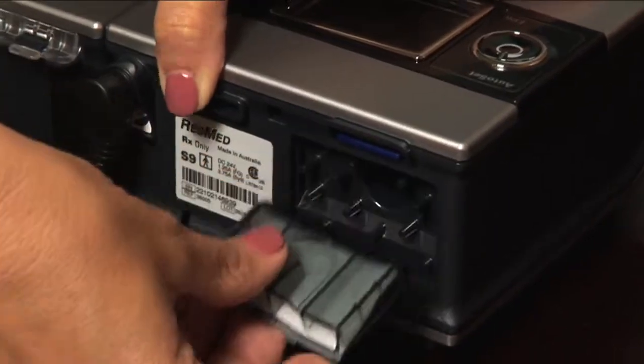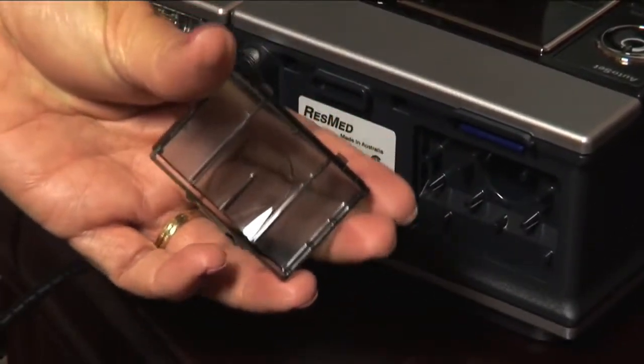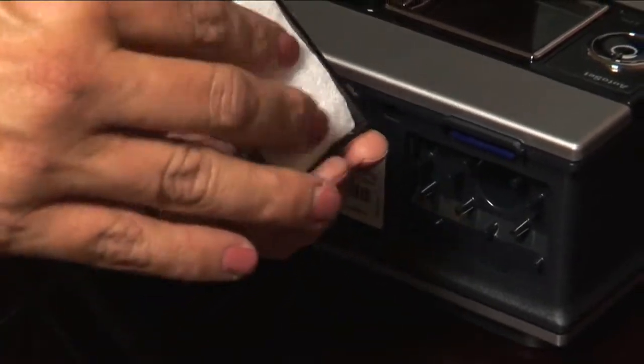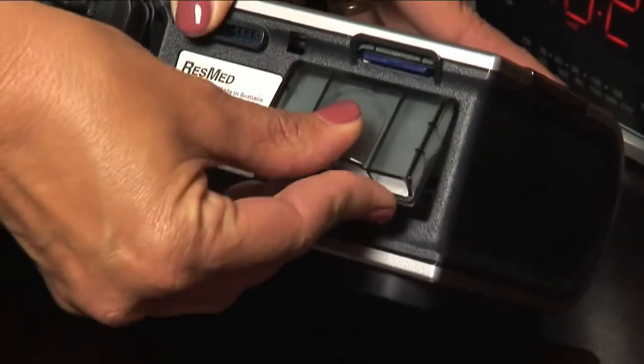Be sure to change the filter on your CPAP system every six months and the tubing every three months. If for some reason you feel your device is not operating correctly, please contact your home care provider for assistance.